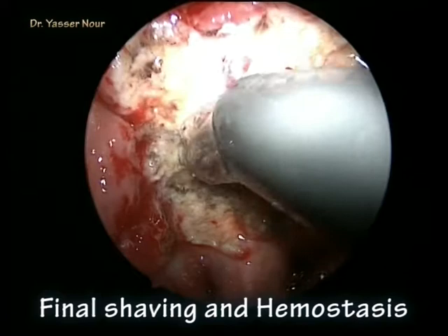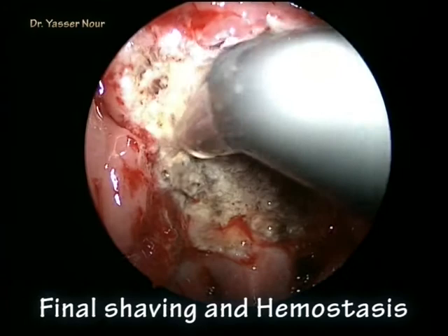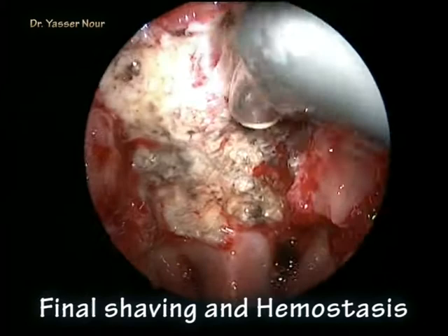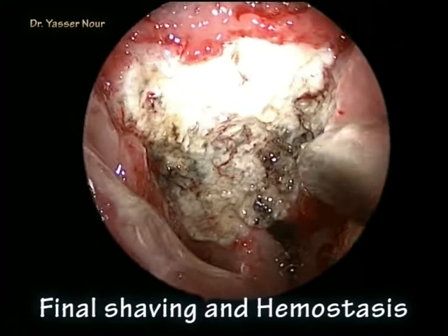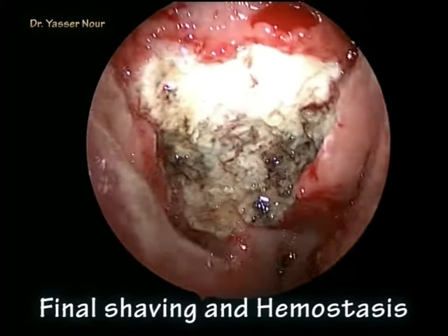The blood loss is really minimal using coblation, and the tissue damage is very minimal because the heat generated by coblation is not as high as with diathermy or laser. This is the final appearance of the adenoid bed — you can clearly see the posterior end of the vomer, the two Eustachian tube orifices, and the posterior end of the inferior turbinate bilaterally.